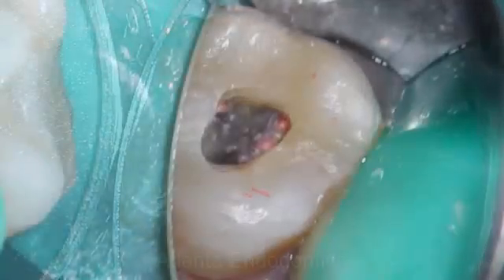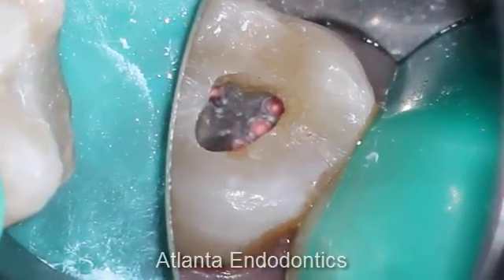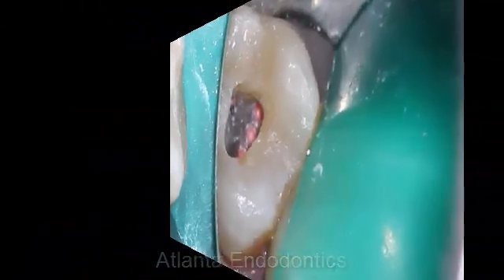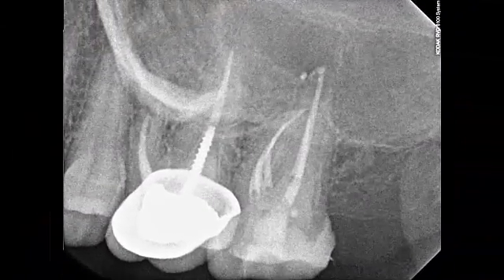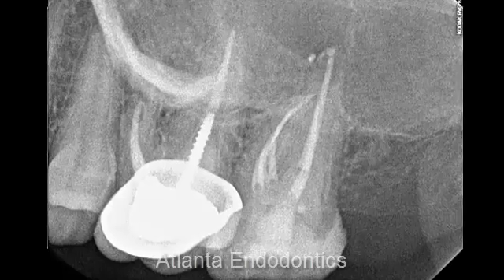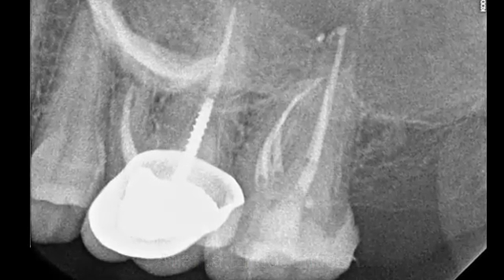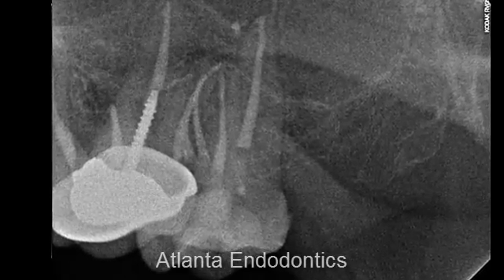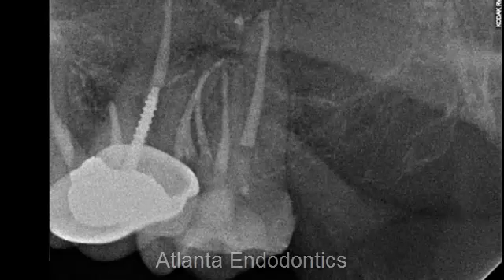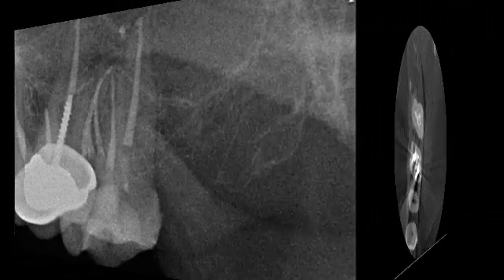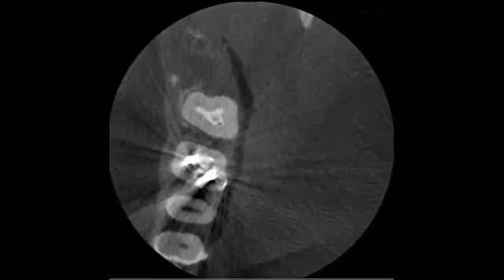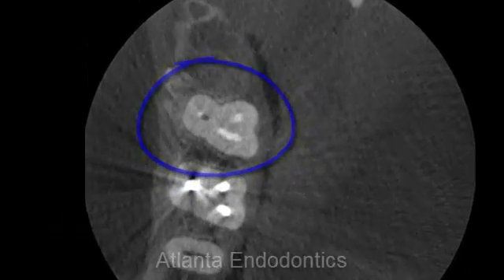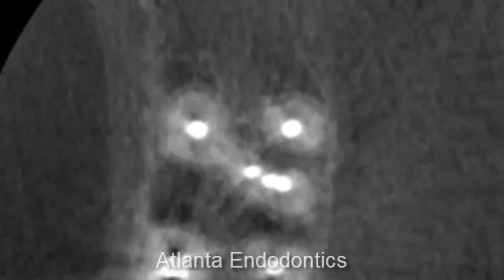Here's the case fully obturated, and here are the post-operative x-rays. The off-angle shot helps to show the case a little bit better. The cone beam scan also gives us an idea of how good a job we've done three-dimensionally sealing this tooth. You can clearly see the three mesiobuccal canals.